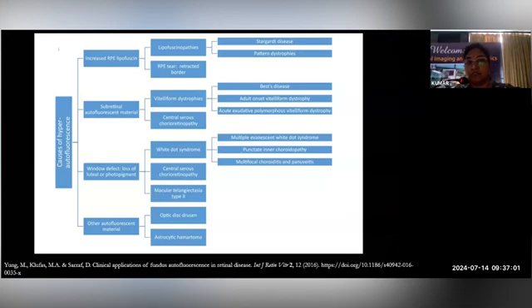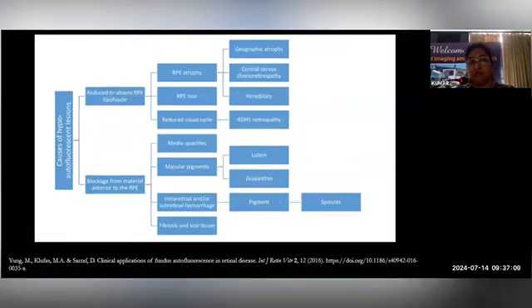So the common causes of hyperautofluorescence are Stargardt's disease, pattern dystrophies, Best disease, adult onset vitelliform dystrophies, and CSR. Interestingly, CSR is one of the causes of both hyper and hypoautofluorescence. All the inflammatory conditions of the uvea, like multifocal choroiditis and punctate inner choroidopathy, also cause hyper-AF. The hypo-AF is caused by geographic atrophy, hereditary conditions, or any scarring of the retina.